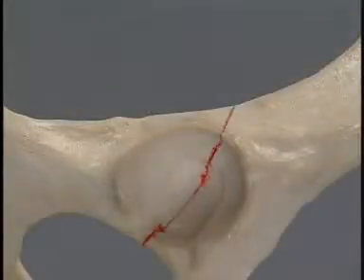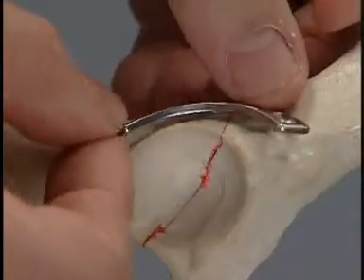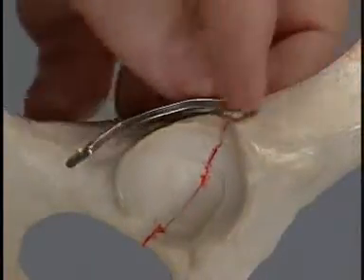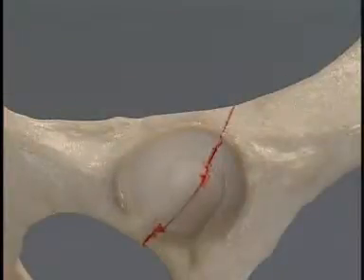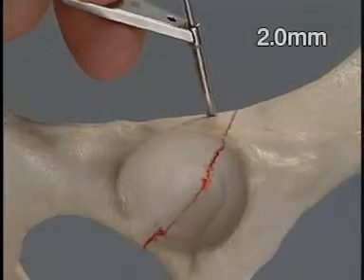While one participant holds the fracture reduced, the other positions the plate over the dorsal rim to assess where the first screw hole should be drilled. The hole is created with the 2mm drill bit through the double drill sleeve.